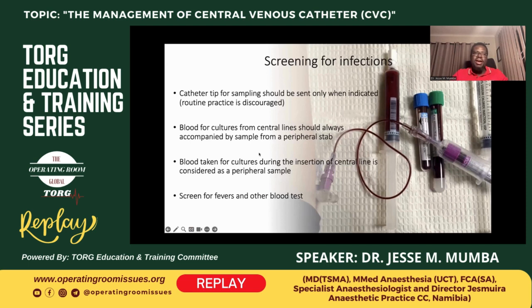But if you ever have to do a blood culture from the central line, it should always be accompanied by one from a peripheral stab. This is just to make sure that if you culture something from the central line but not from the peripheral stab, then usually that indicates that it's not a bloodstream infection. You just didn't draw the blood well.